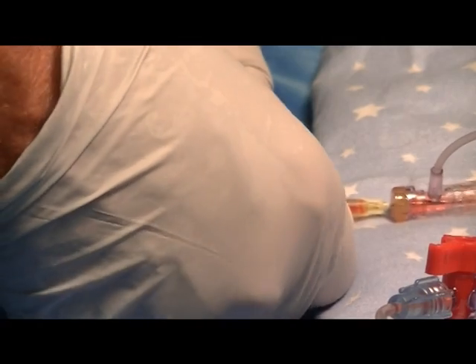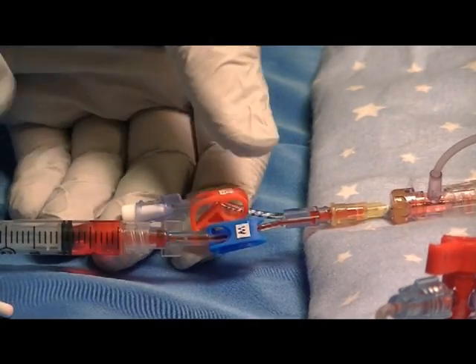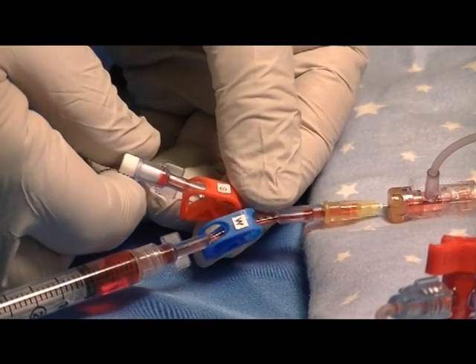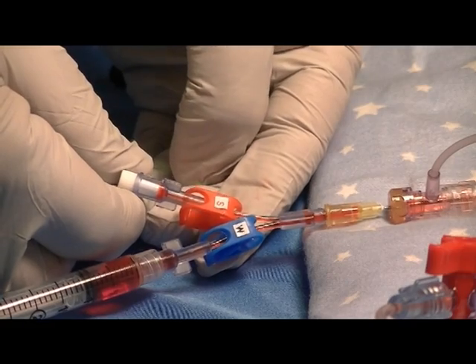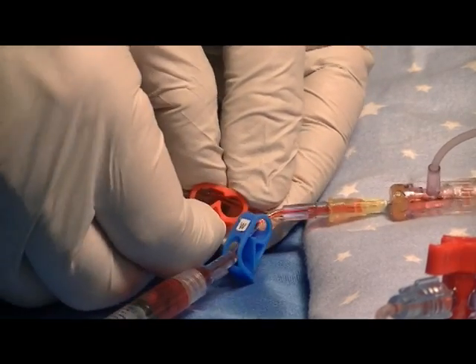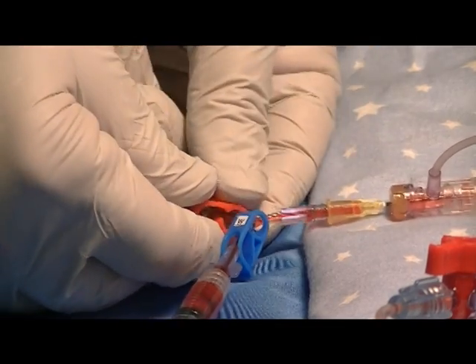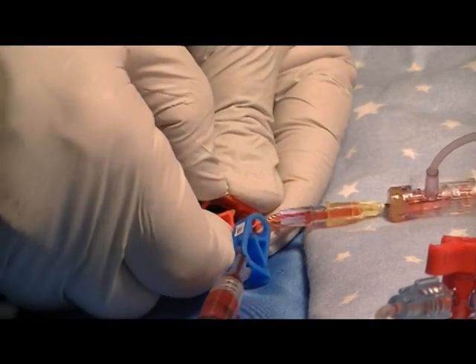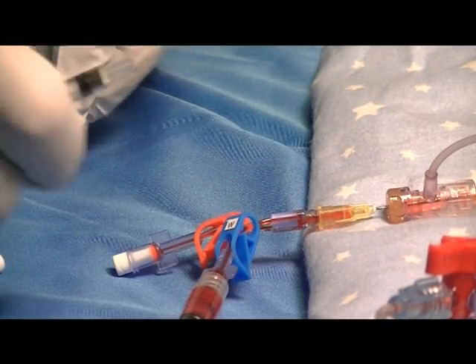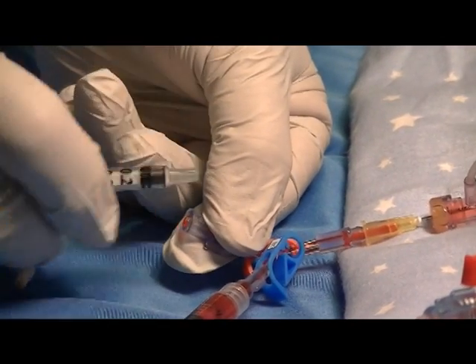Re-clamp and leave that waist syringe in place. Next, unclamp the sample side clamp and allow blood to come back to the white vent plug. Clamp that back and attach the 1ml heparinized blood gas syringe to the sample side.